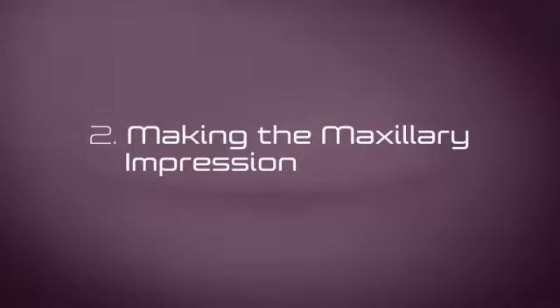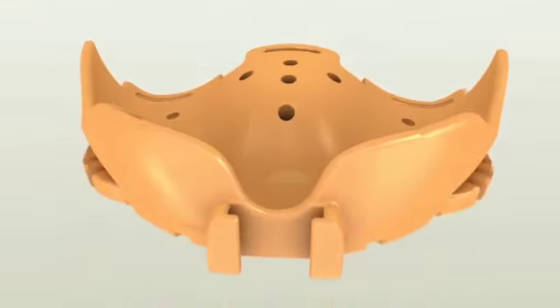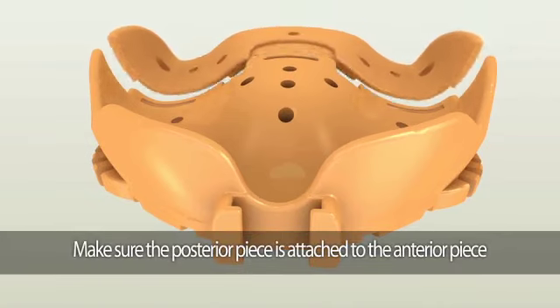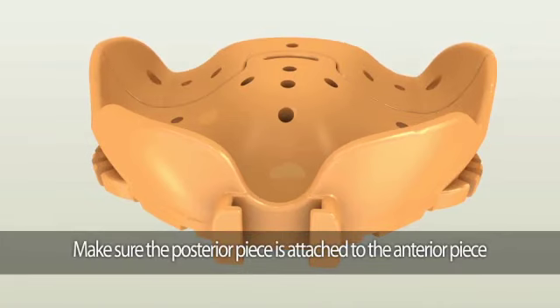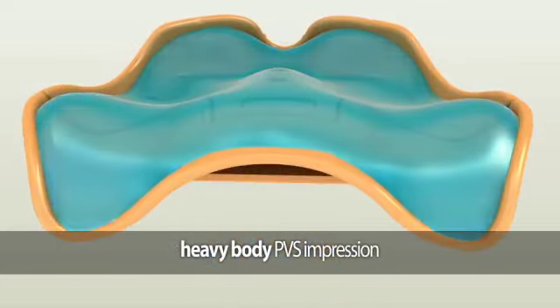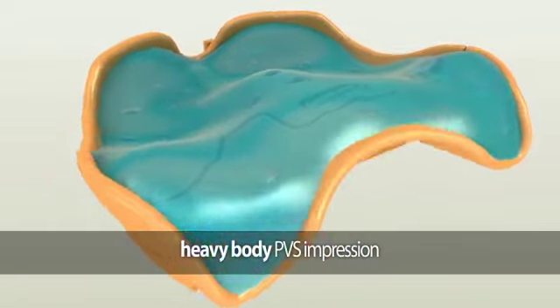Making the maxillary impression. The maxillary Pala digital denture tray consists of two pieces: the anterior piece and the posterior piece. Make sure the posterior piece is securely attached to the anterior piece. Completely fill the maxillary Pala digital denture tray utilizing fast-setting heavy or medium-body PVS impression material, such as Flexi-Time Fast and Scan.